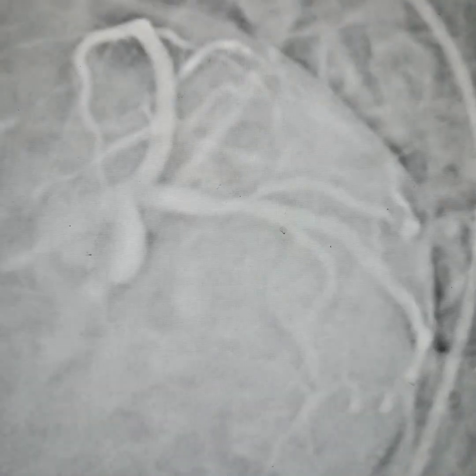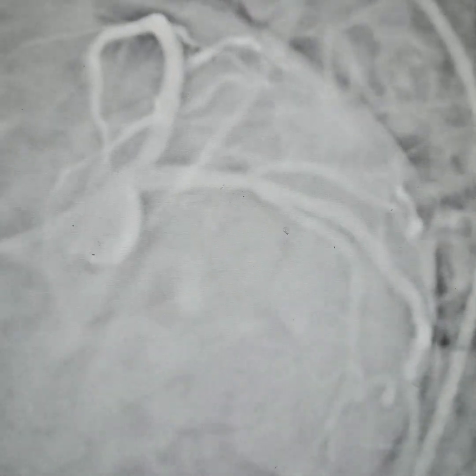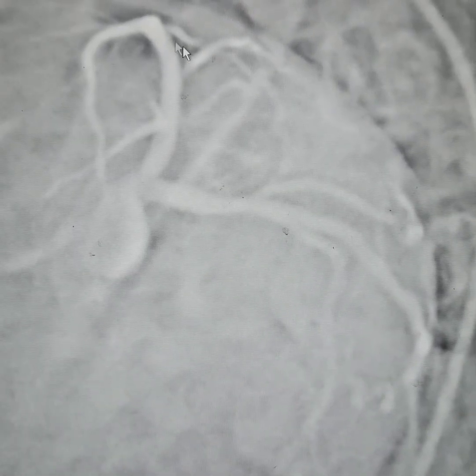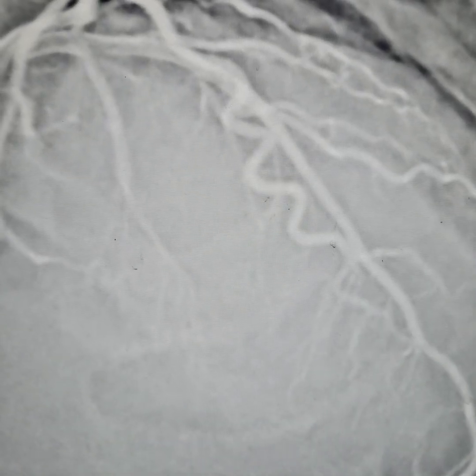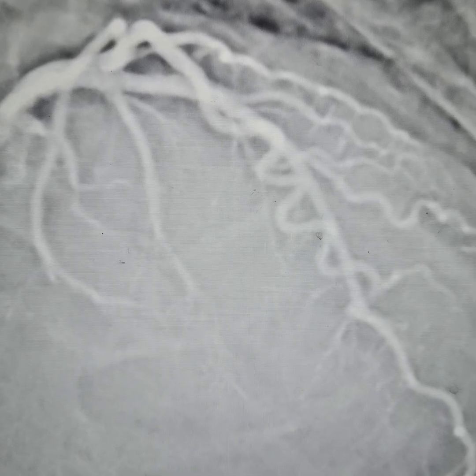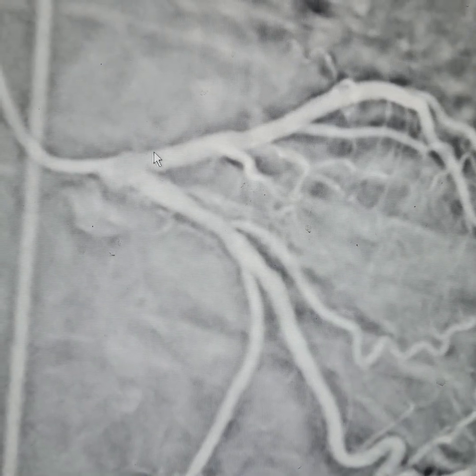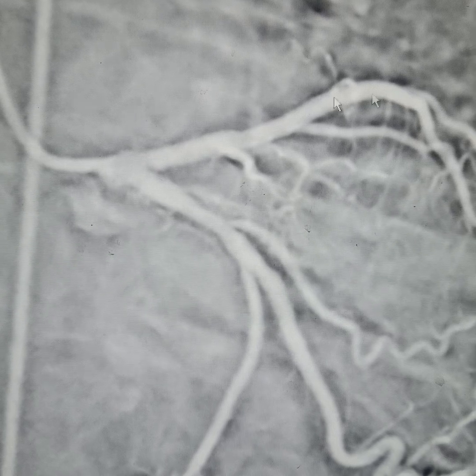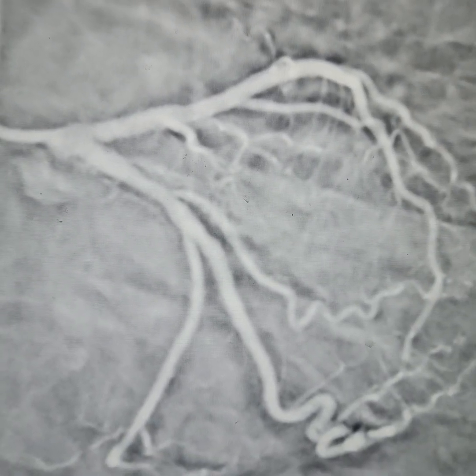Again it will be checked — good stent expansion all throughout. This is the beauty of good stent placement and using stent boost technology: you can really appreciate the excellent result. Good stent expansion overall, and this is how a good result can be obtained. Thank you.